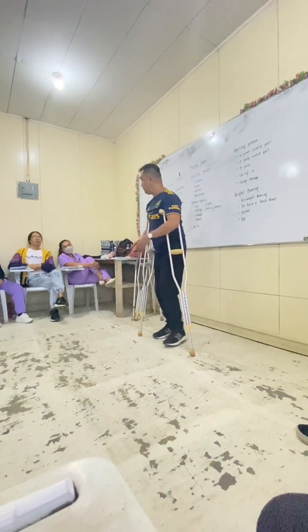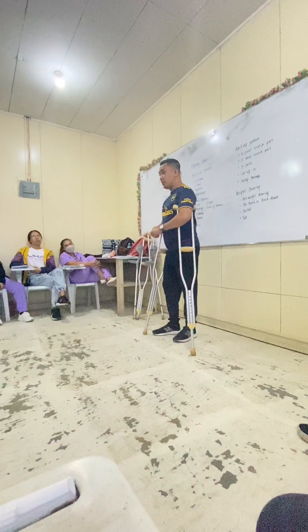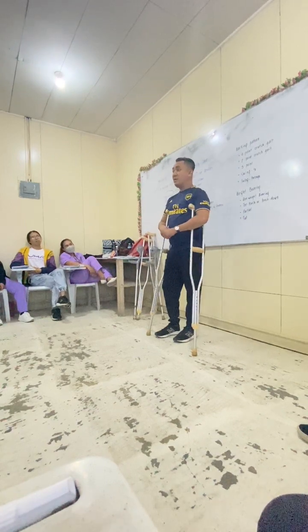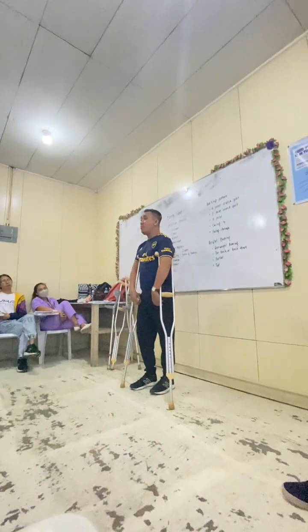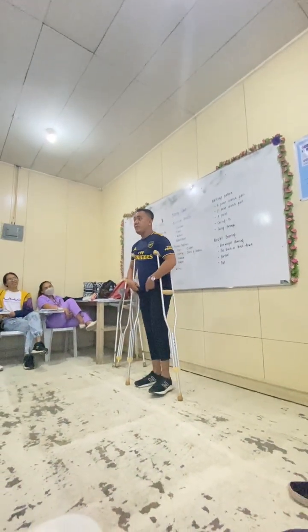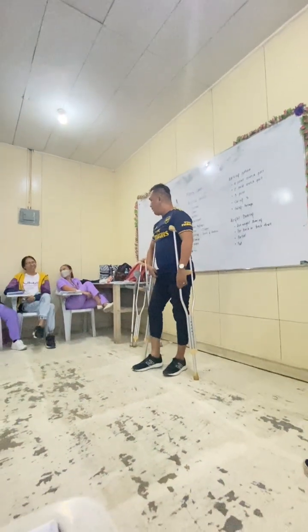So may mo suggest ano sa PT and physicians. Uy, caregiver, it's not your role to choose kung siya gamiton na kung ayaw mo pagbukbuk. It's the job of the physician and the PT.